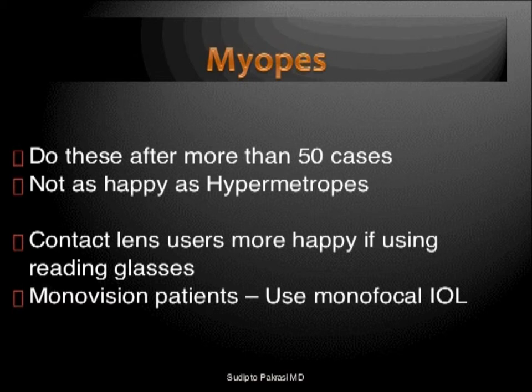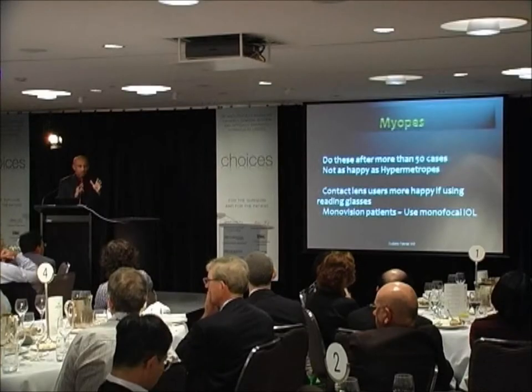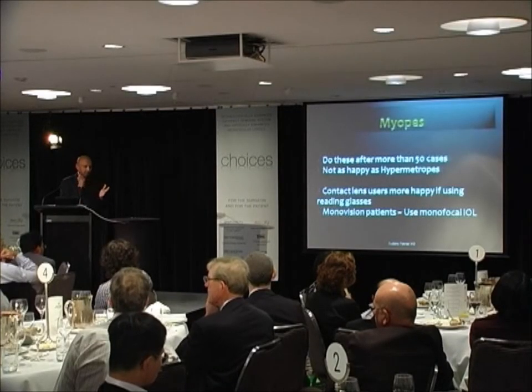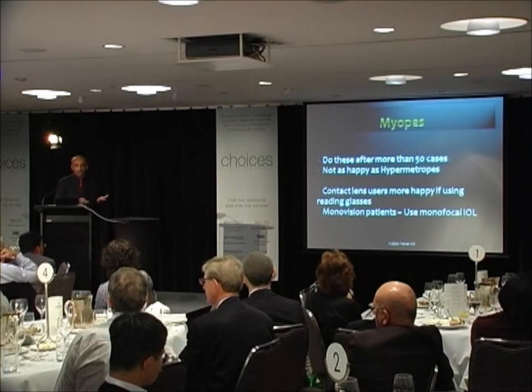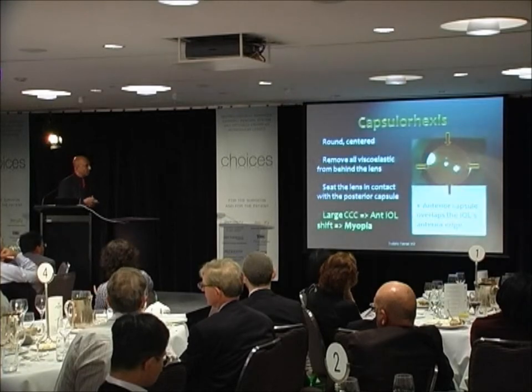Some special situations, myopes. I have been a bit careful with the myopes. Now they are not extremely happy, as I mentioned earlier, but if the people are wearing contact lenses and if they are using reading glasses, there's a different subset of people who use monovision. So you have to really weigh the pros and cons before you take up the myopes. And I'm sure after you do 50 to 100 cases, you realize what you're doing to your patients.